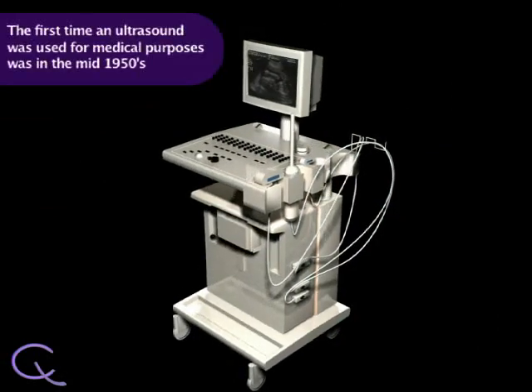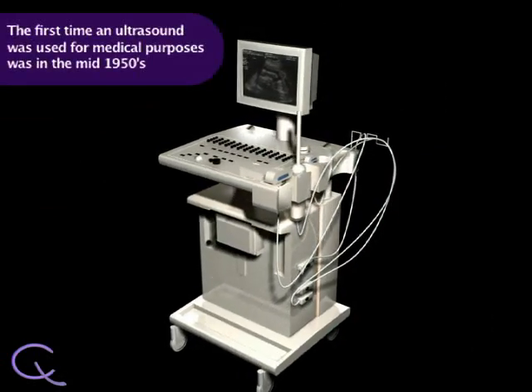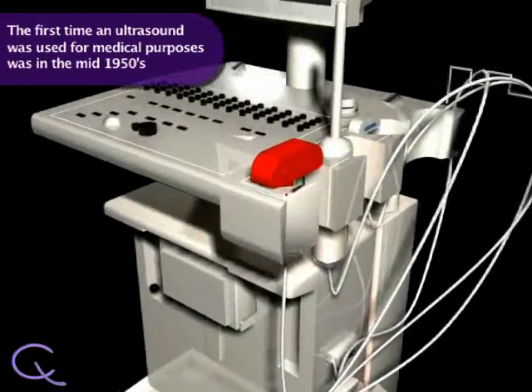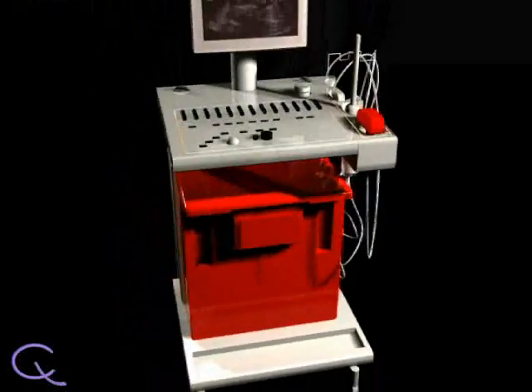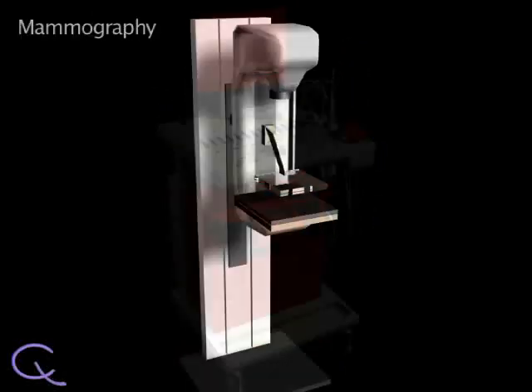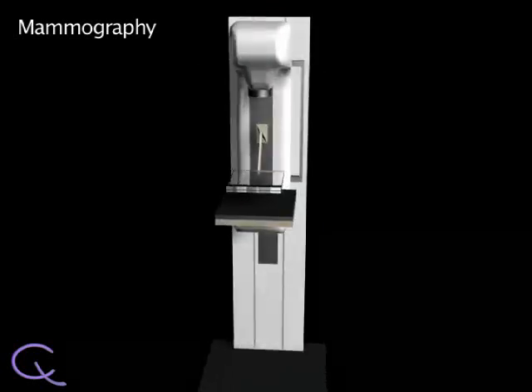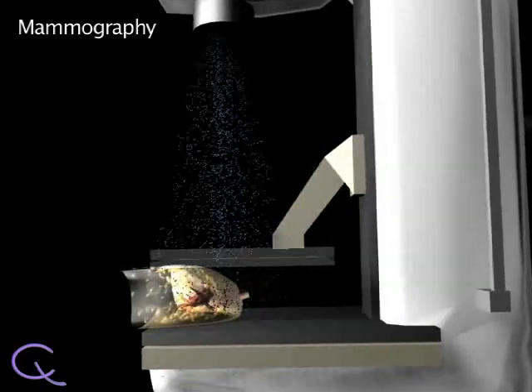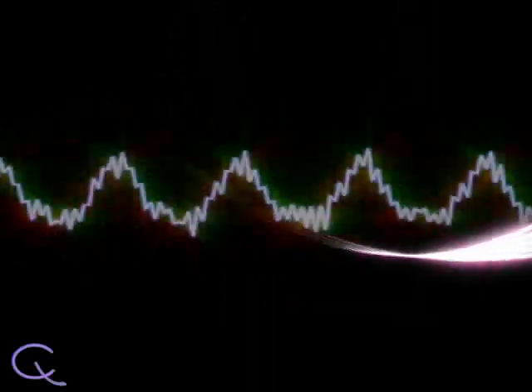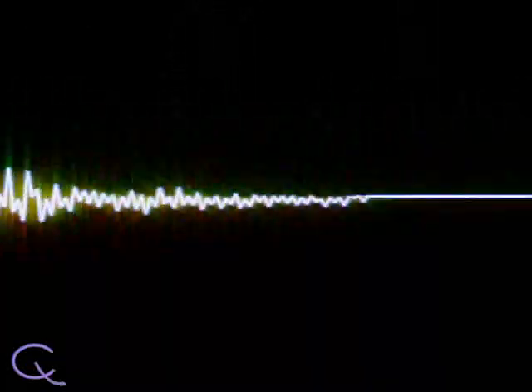The ultrasound machine consists of three main parts: a handheld detection device known as a transducer, a computer that processes the sound waves, and a monitor that shows the images. It is different from mammography and other imaging techniques that use X-rays to create an image. Instead of X-rays, ultrasound uses high-frequency sound waves.